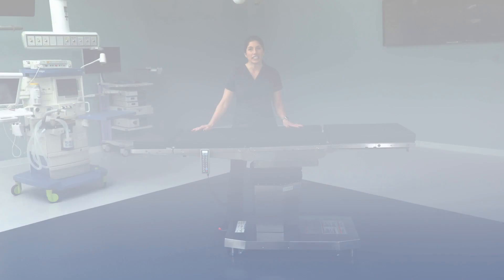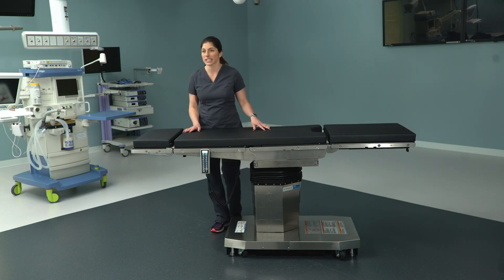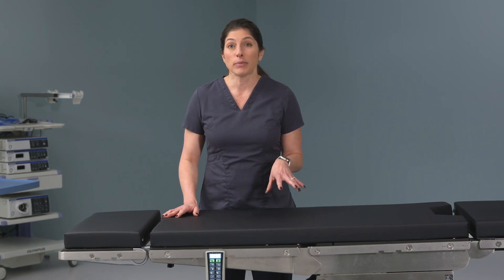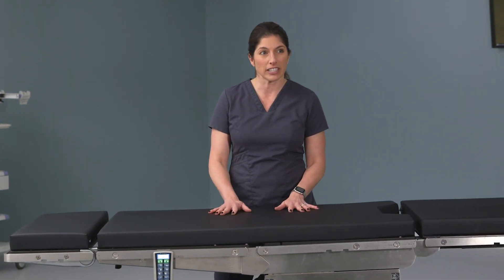Good morning everyone, thank you for being here with me this morning. My name is Michelle and I'm with Steris. As you all know, you have 3085 tables throughout your ORs, but today — and actually this week — we will be trialing some new technology for you, and that is the 5085 general surgical table.